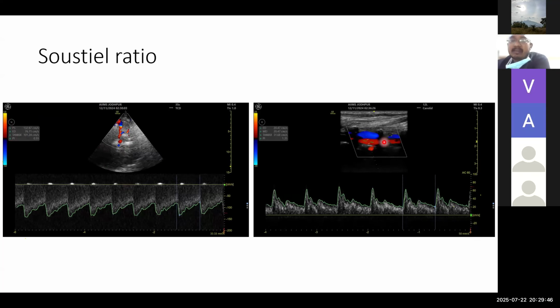And I'm the one who said that you need to use a phased array probe, and I'm the one who is breaking the rule. Because I'm unable to insonate vertebral arteries extracranially with a phased array probe, I've chosen an alternative to insonate the vertebral artery extracranially using a linear probe. Maybe I'll learn soon. And the TMAX here I have recorded is 31.